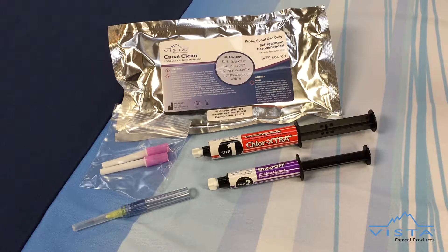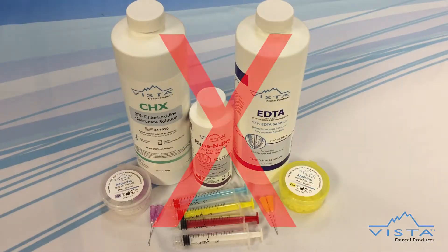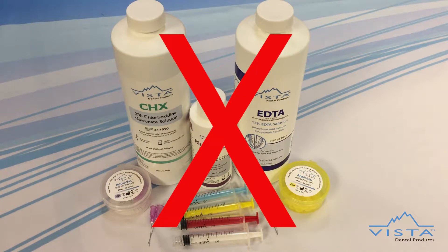Endodontic retreatment rates have increased by over 35%, in part due to improper irrigation techniques and protocol. To combat this, Canal Clean offers everything needed for optimal tissue dissolution, canal disinfection, and residual kill of bacteria in one convenient kit.